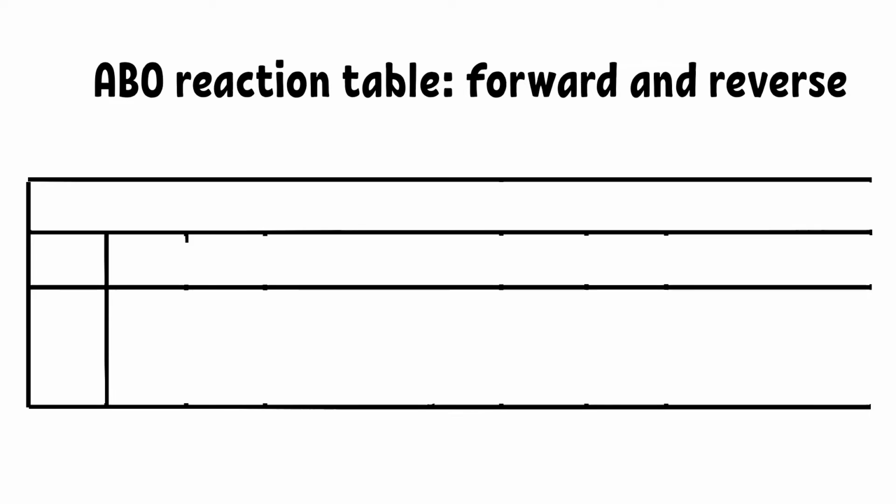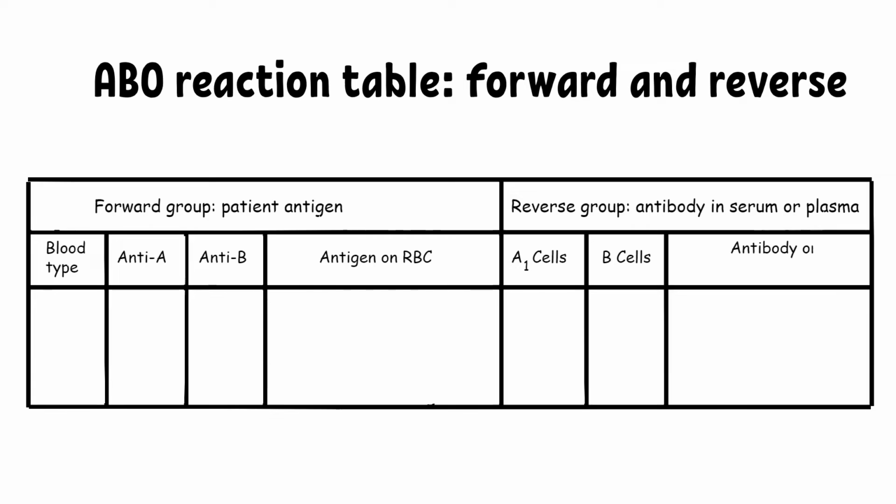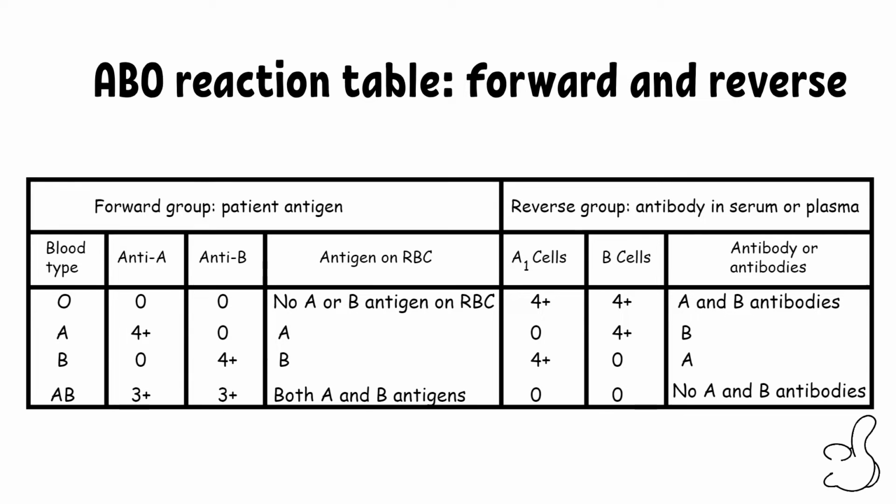Now that we understand what to expect for common blood group reactions, we can take a look at the unusual reactivity. You will think of ABO subgroup or discrepancy when you perform ABO grouping testing and the forward and the reverse don't match. ABO subgroups represent phenotypes showing weaker reactivity with commonly used reagents.